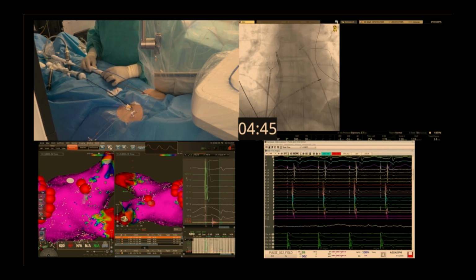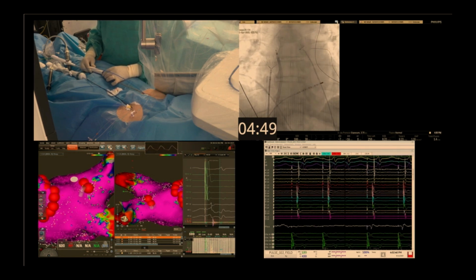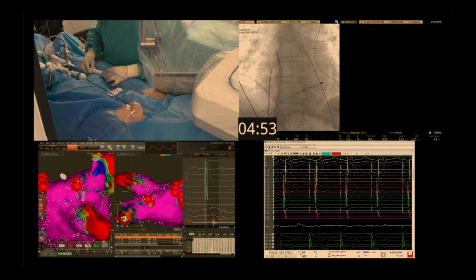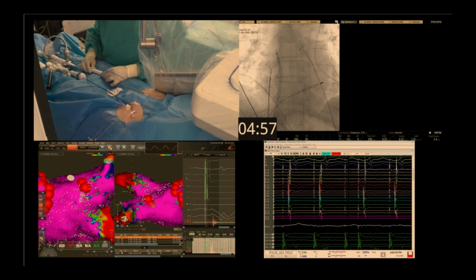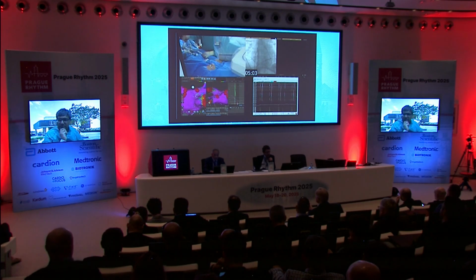The esophagus, the data looks just like most of the other catheters. I talked to you about the brain MR imaging. What else? Vivek, just one other question, just a little bit of segue. What do you think about this for, say, slow pathway or accessory pathway ablation?